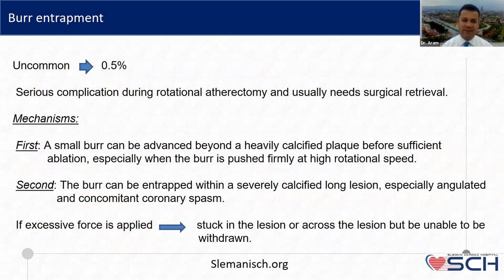This is a very nasty complication. This is a nightmare. Actually, burr entrapment is a nightmare. Fortunately, the incidence is very uncommon. It's 0.5%. It's a serious complication during the procedure and usually needs surgical retrieval. Usually we need surgical treatment to retrieve the stuck burr. The mechanism, you have two mechanisms. This is very important. This is preventable. To me, burr entrapment is a preventable complication. Why? Because the mechanism is so clear.